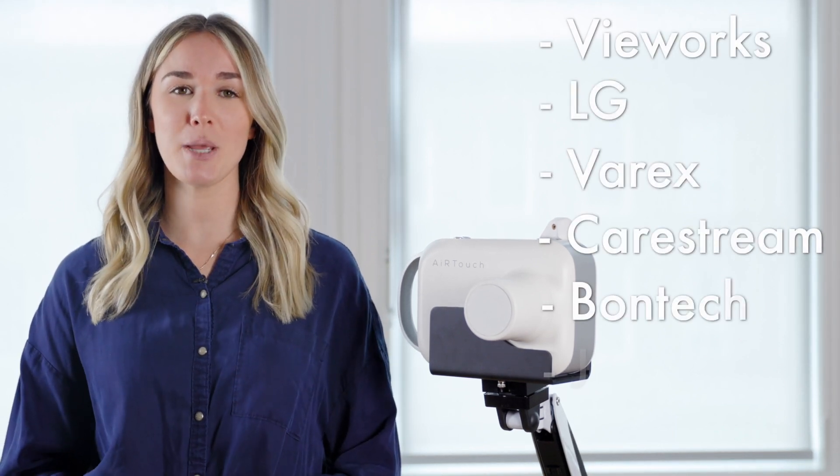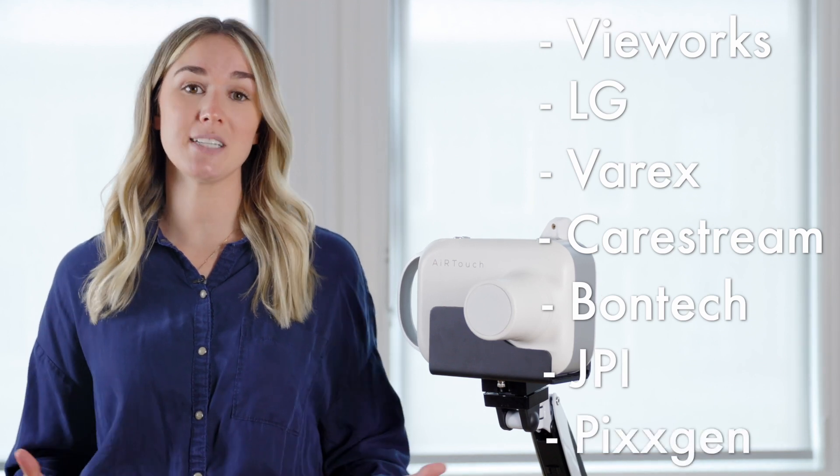The device is compatible with a variety of detectors such as ViewWorks, LG, Verix, CareStream, Bontech, JPI, and PixGen, and the list is always expanding.